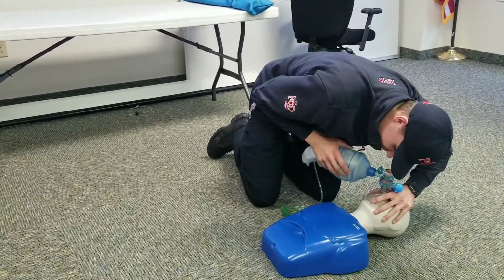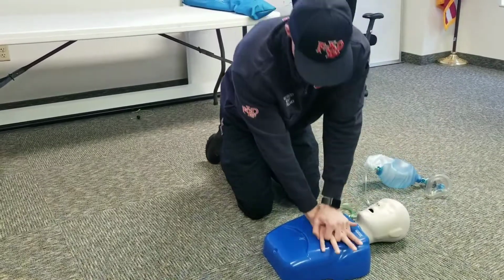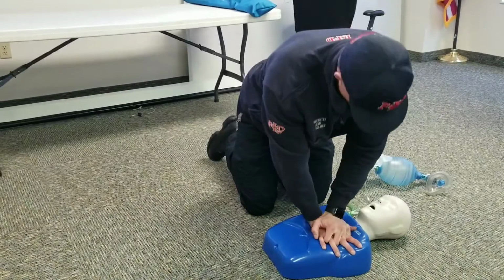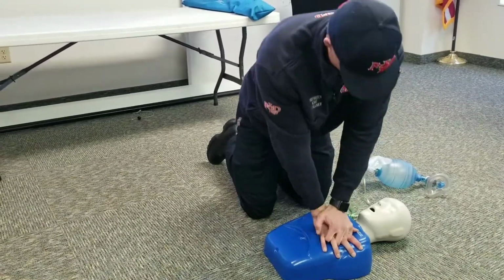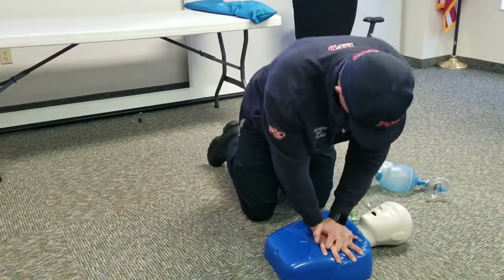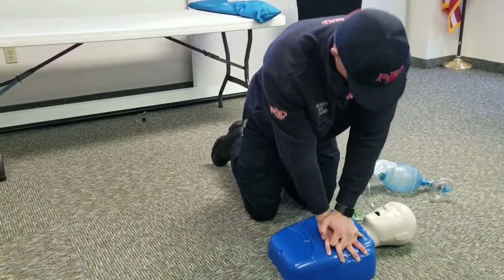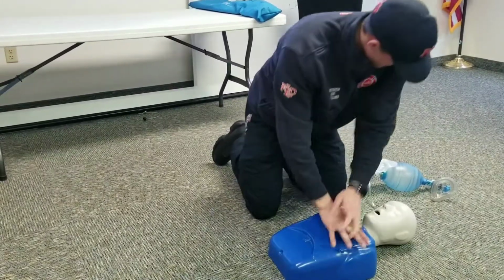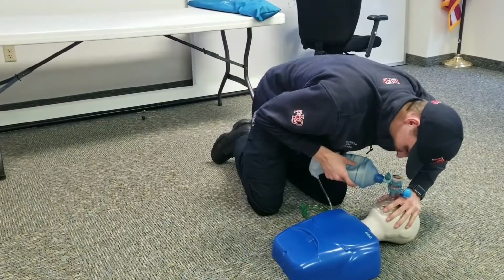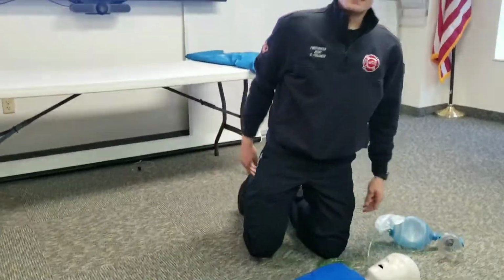This will be the last cycle right here. And then you're just going to continue that until EMS crews arrive or an AED comes, and until basic or advanced life support arrives.